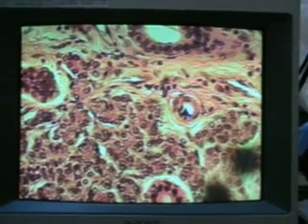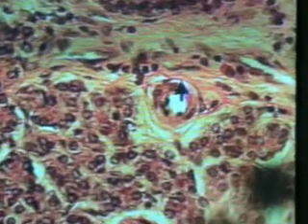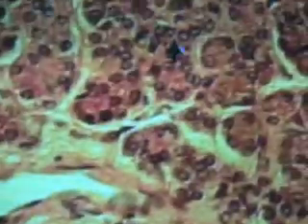Even though it's pulled away, you can see the striations, and you see the way the nuclei are more in the center of the cell, and they're larger ones. You can see the lumen, and those are going to be easy cells for you to identify. Maybe your slides are not quite as dry. This, of course, is a little arteriole. As you can see, there's some smooth muscle cells around that one, and it's really quite different in the way the whole histology is constructed.